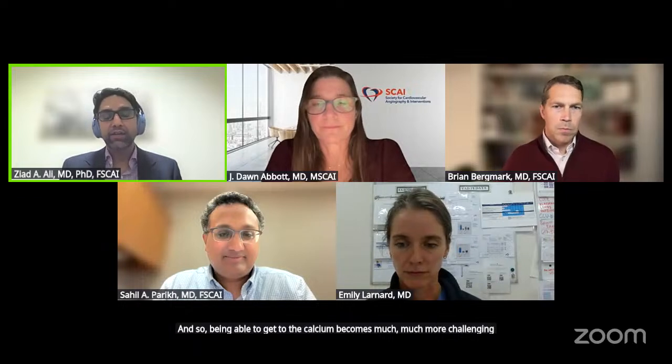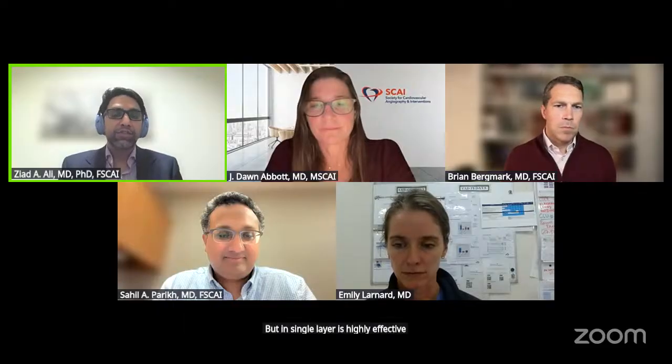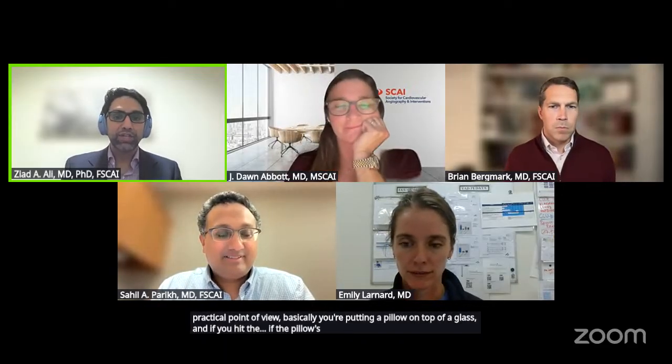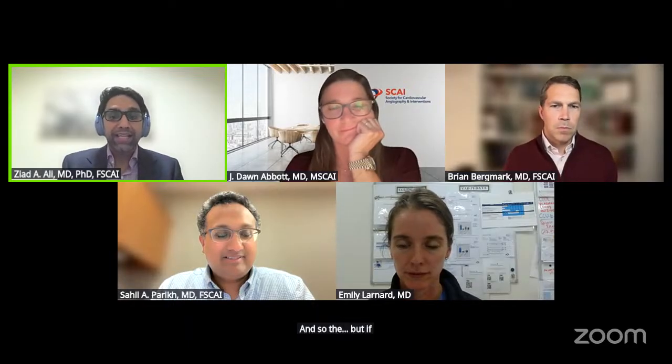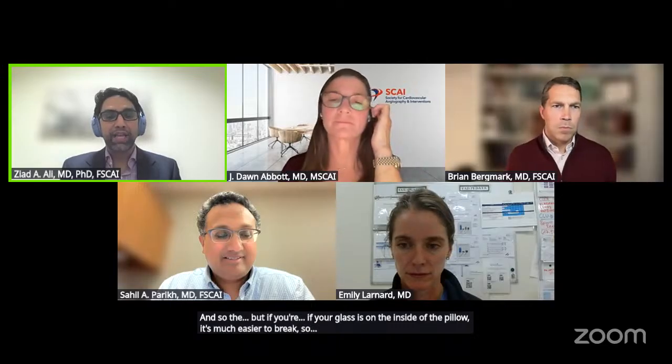In fact, we even showed that shockwave is much less effective in double layer ISR because of the layers of neointima that cover the calcification, but in single layer is highly effective. So you think of it from a practical point of view, basically you're putting a pillow on top of a glass. If the pillow's big and spongy and you hit it with a hammer, it won't break. But if your glass is on the inside of the pillow, it's much easier to break. So the depth of calcification is very, very important for your lesion preparation success.